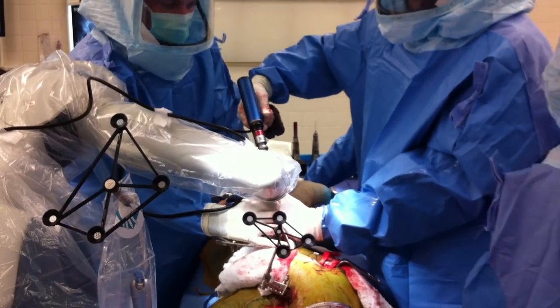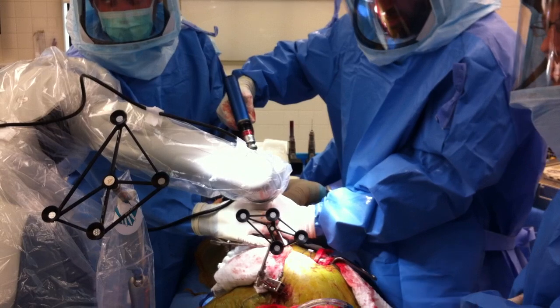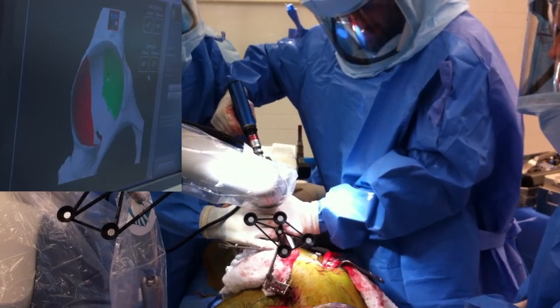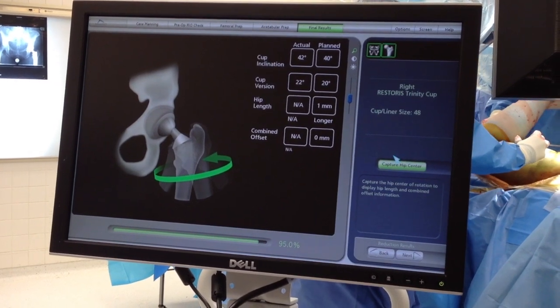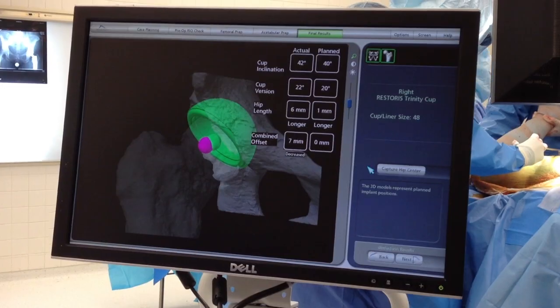The robot does not, obviously, do the procedure, but rather provides a framework for the surgeon in order to be able to place the components in the desired location. Once the cup is placed, we check the orientation and ensure that the cup has been placed accurately. We'll then follow our plan for placing the femoral component with the correct version, and finally check the relationship between the femur and the cup during joint motion.